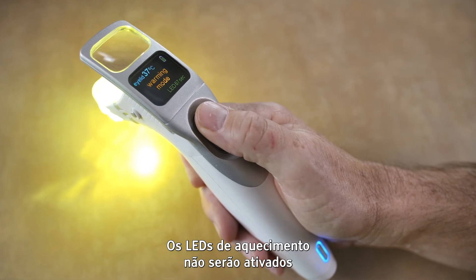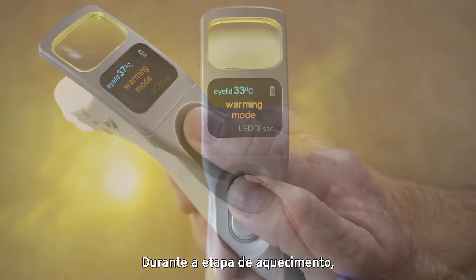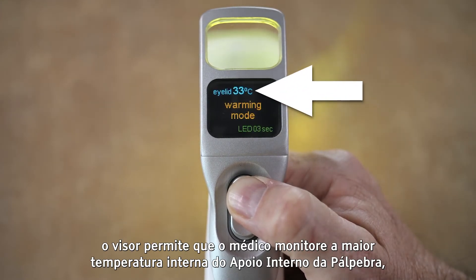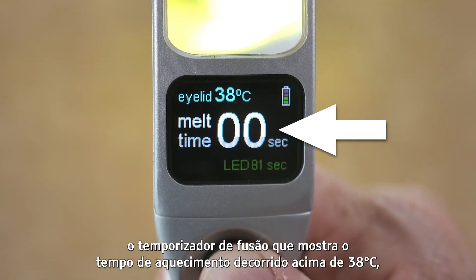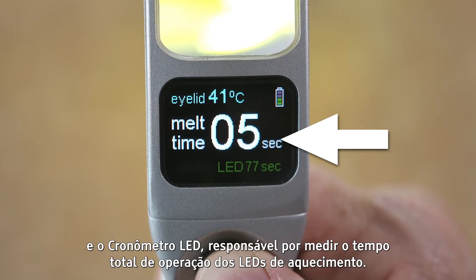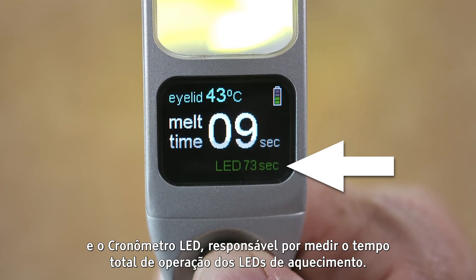The warming LEDs will not activate unless the smart tip patient interface is attached. During the warming phase, the display screen allows the clinician to monitor the warmest inner eyelid pad temperature, battery capacity, the melt time — which tracks elapsed warming time over 38 degrees Celsius — and the LED timer, which measures the total amount of time the warming LEDs are operating.